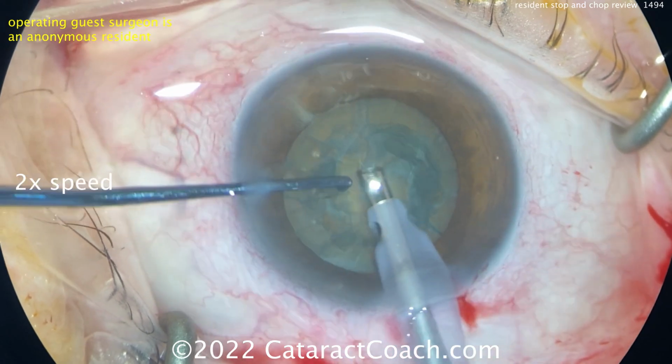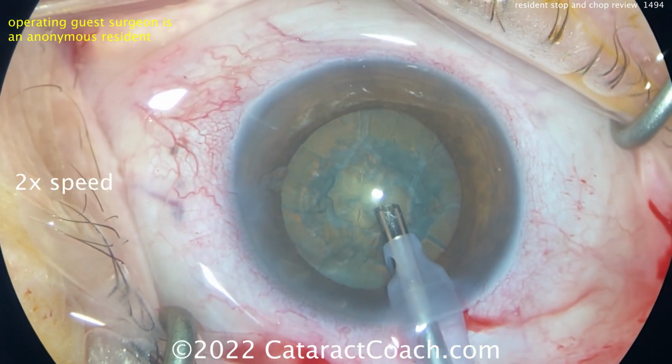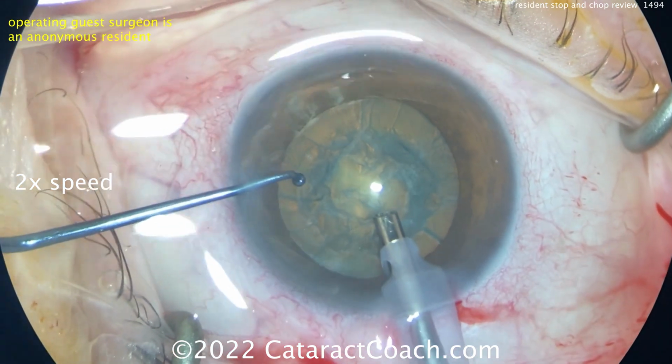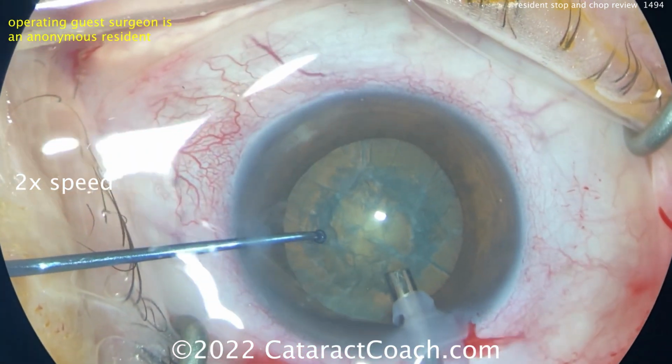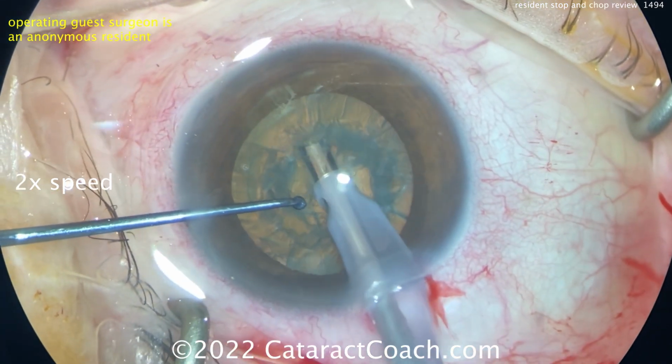We've zoomed right ahead to the phaco probe in the eye, and let's see the initial groove. Now, the nucleus is on the softer side. Be careful not to put too much phaco energy in the eye. Be cautious when creating these grooves. So a little bit of energy going in here, and that looks like a nice groove.